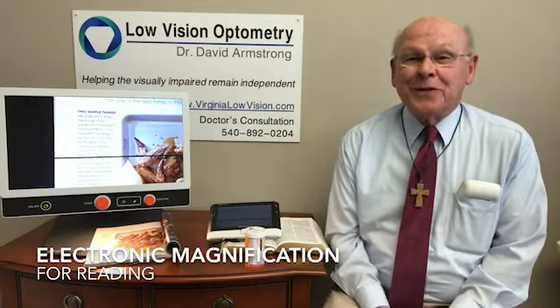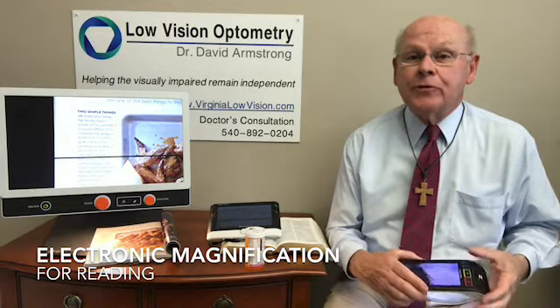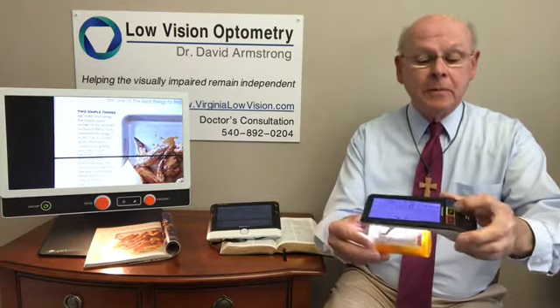There are a variety of electronic magnifiers available that can be suitable for a number of situations, particularly in cases where people require more magnification than what we can put in eyeglasses. This is one that I have used many times that is quite versatile. You're able to read the label on this medicine bottle, and we can increase the magnification — make it even bigger. It has four different magnifications.